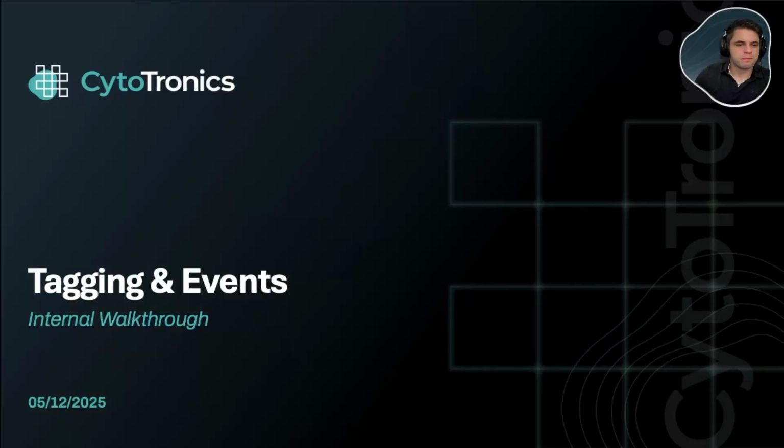Hey everyone. In this walkthrough, I'll be introducing a new feature we've added to our software, the ability to tag scan loops and view them within an interactive timeline. This feature is designed to improve how we analyze, organize, and navigate measurements, making it easier to recognize meaningful scans and interventions. In this video, I'll walk through what's new, highlight some of the important changes to the project workflow, and give you a preview of where we're heading next with this capability.